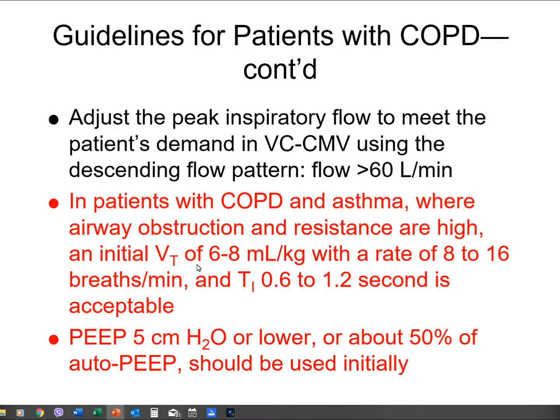All right, so we still want to keep the tidal volume the same, 6 to 8. The rate is going to drop a bit, and instead of 12 to 20, we're going to go 8 to 16. I time is going to be between 0.6 to 1.2 seconds. But again, watch your respiratory rate. You don't want to go so high.